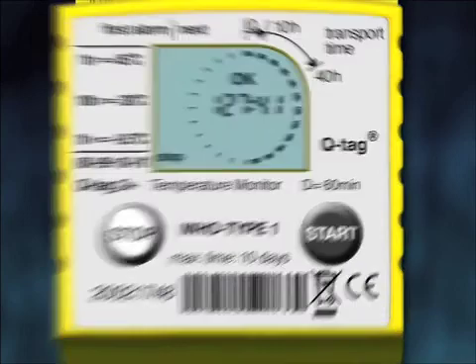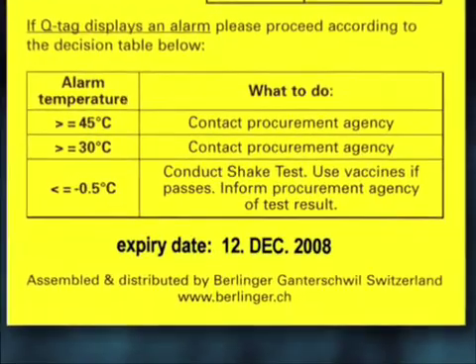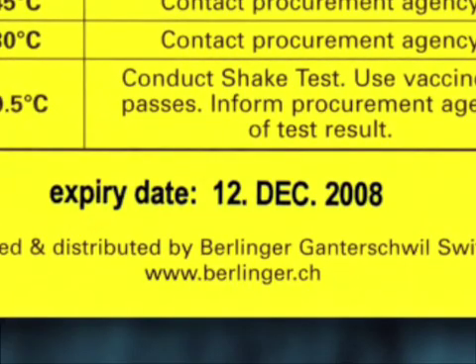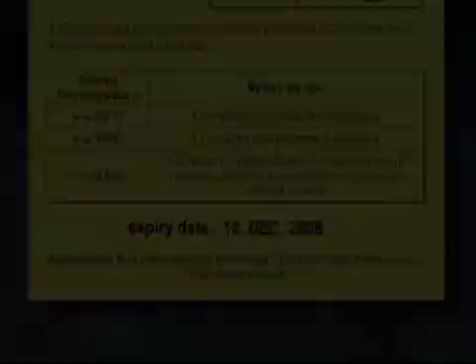The end of the battery life is indicated by the expiry date printed on the backing card. The accuracy and proper function of the device cannot be assured beyond this expiry date. If there are any alarms, you should refer to the decision table above the expiry date on the back side of the card in order to take correct action. Do not forget to make a photocopy or scan the device along with its backing card for documentation.